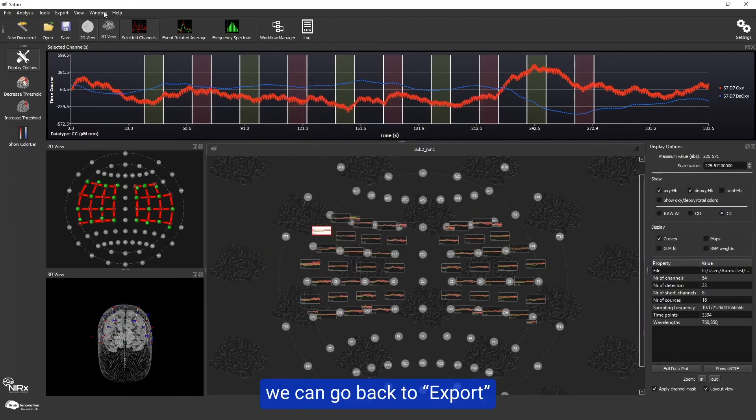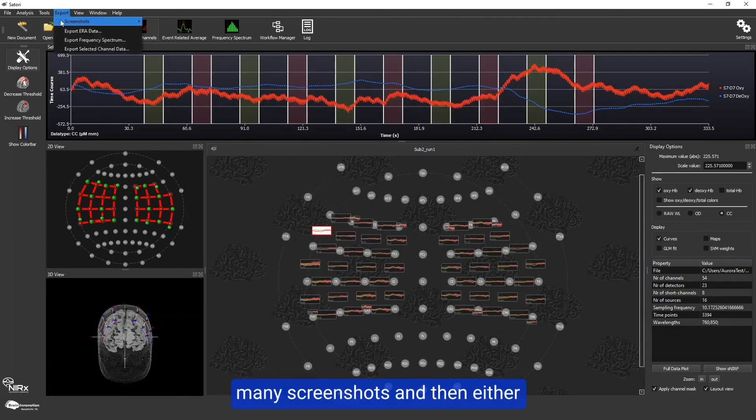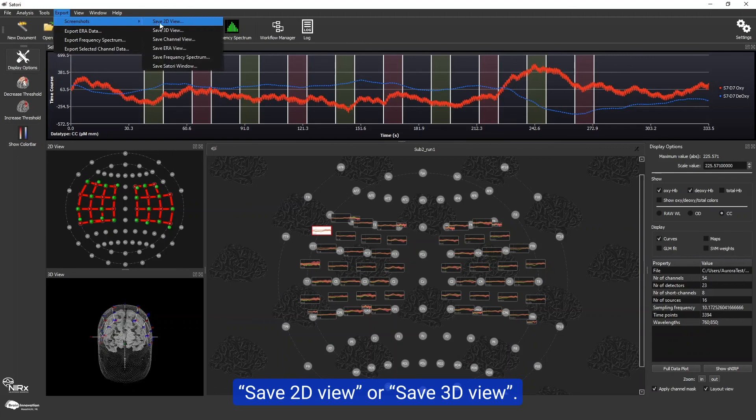we can go back to export, then screenshots, and then either save 2D view or save 3D view. Enjoy your beautiful results!